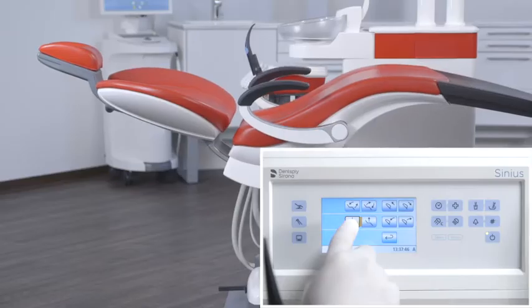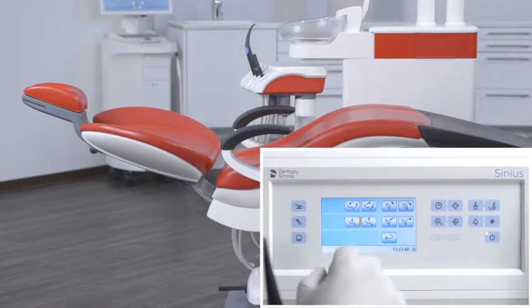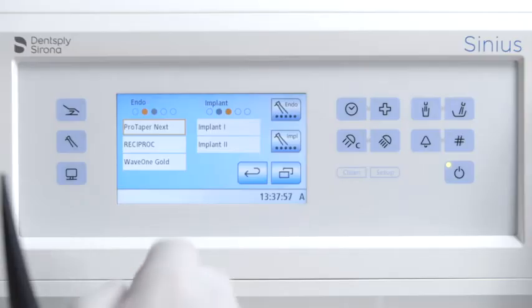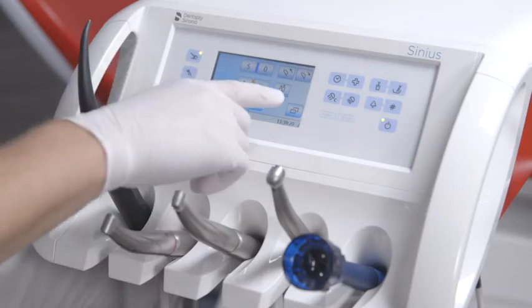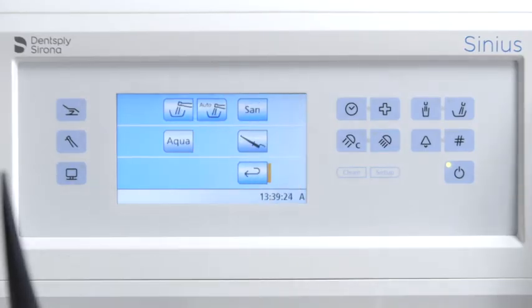With the up and down buttons, you can move the treatment center to the optimal height. The Treatment Function button is your entry point into the implantology or endodontic treatment. The subscreen button gives you access to additional subordinate functions.